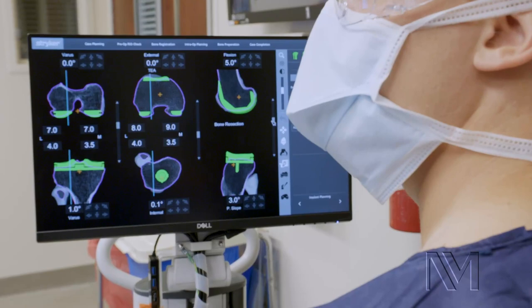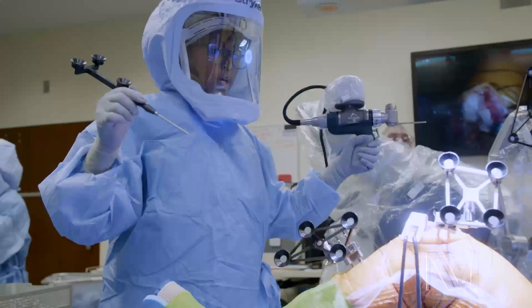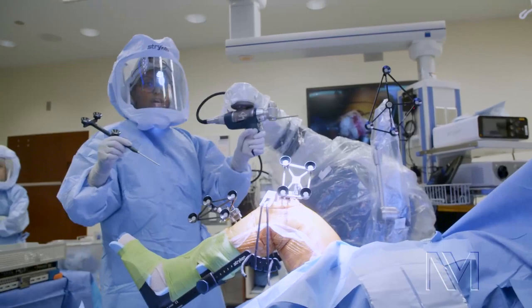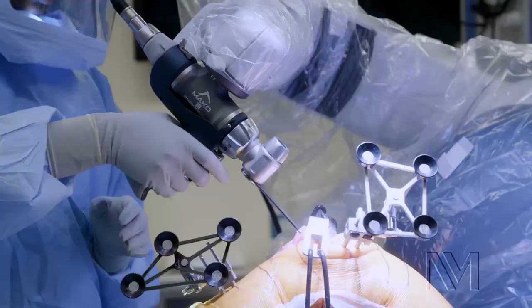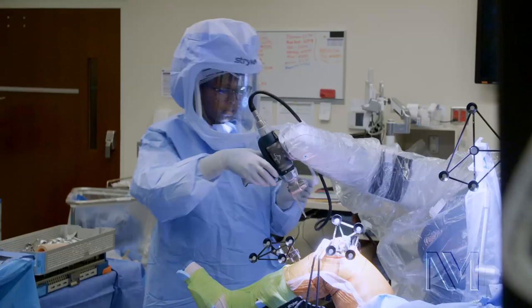And we're now going to do the fun part. We're bringing the robotic assisted arm into place. We're going to start with our tibial cut. I hold the trigger, the robot goes into the exact position where it's supposed to cut. We've now cut the tibia.